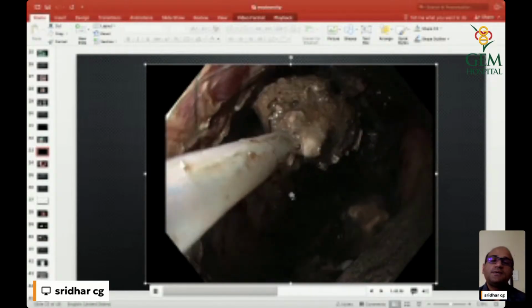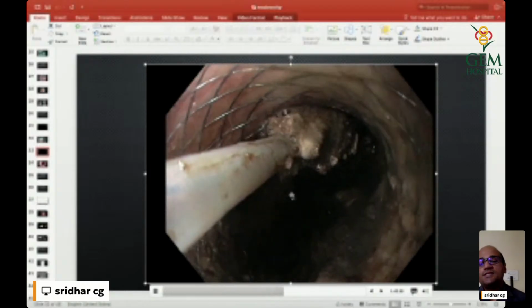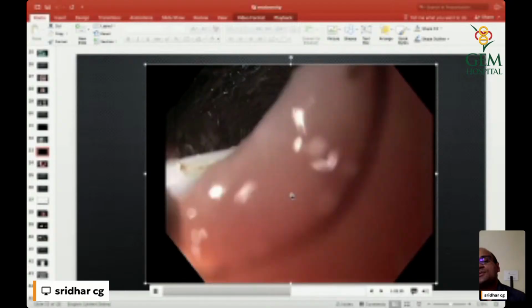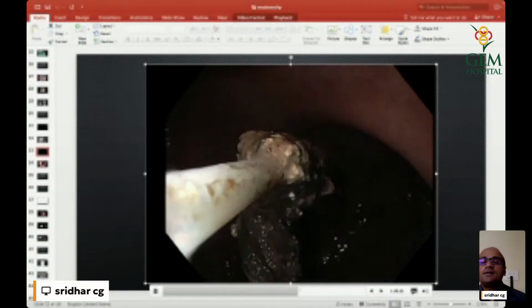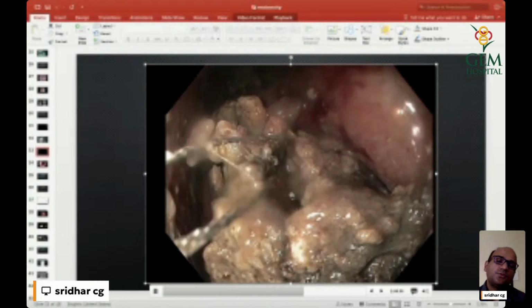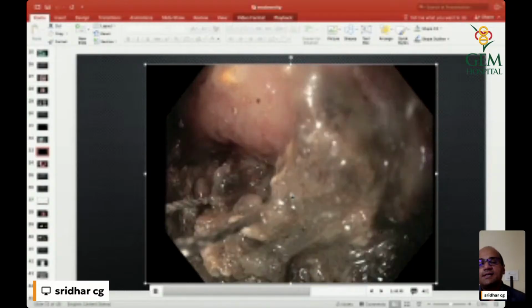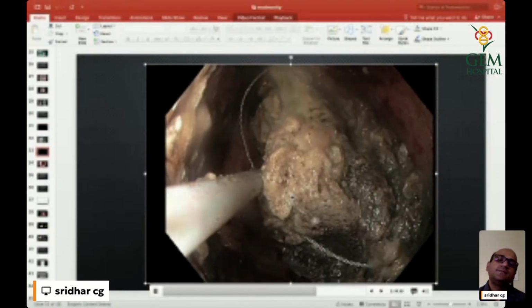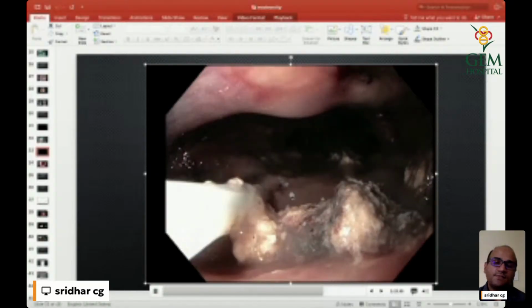See, unlike laparoscopy, we don't have triangulation to catch hold of one with one instrument, having multiple ports and everything. The luxury remains with the single axis, single port. Even with the therapeutic scope, the axis remains the same. So, this is a slow, labor intensive process, but it's always worthwhile, and I'm sure there'll be many more tools in the future to facilitate this debridement. We already have mechanical debriders and electrical debriders to enhance this. It's like a morcellator where the whole necrosectomy and debris removal can be done in a very fast paced fashion.